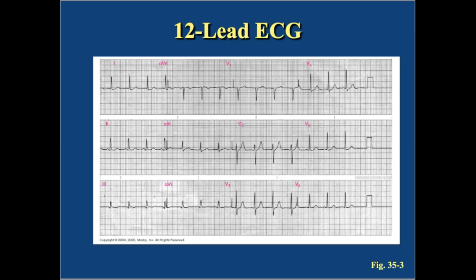The EKG tracing basically represents the electrical activity that occurs when the sodium and potassium ions switch places in the heart. The atrium and ventricles contract, and they depolarize and then they repolarize. This is what it looks like in an electrical setting, okay? You will not be learning 12-lead EKGs today, but I wanted you to at least see what one looks like.